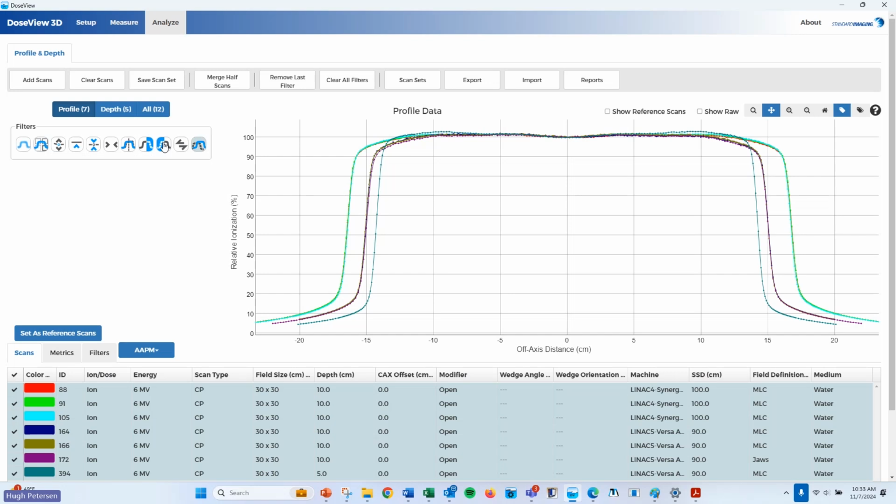Here's some filters you can choose. I'll kind of touch on these up here, but the filters, I've got a couple different smoothing filters. I've got a boxcar and a Gaussian. I can do a point edit. So if I get like kind of a wonky point for some reason, I want to just clean that up, and smoothing didn't do that, I can edit that single point.